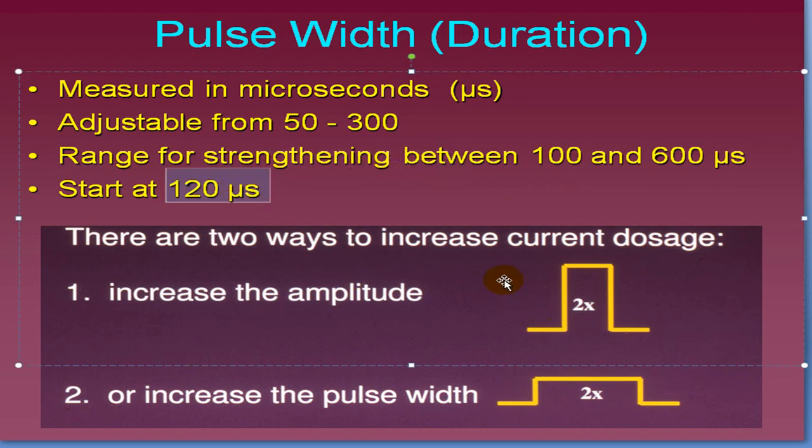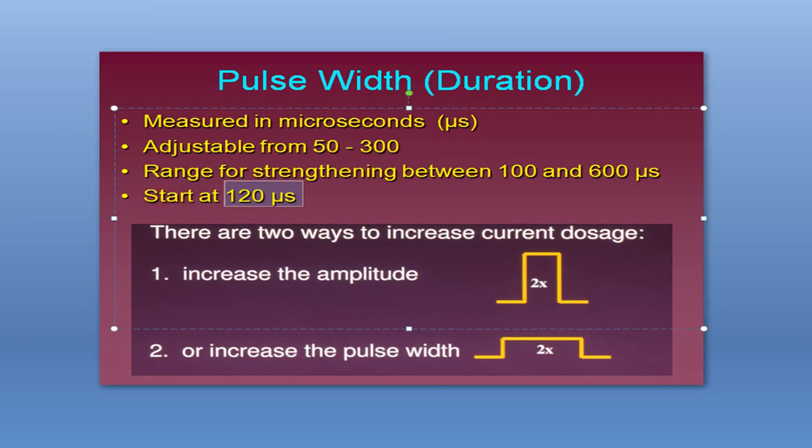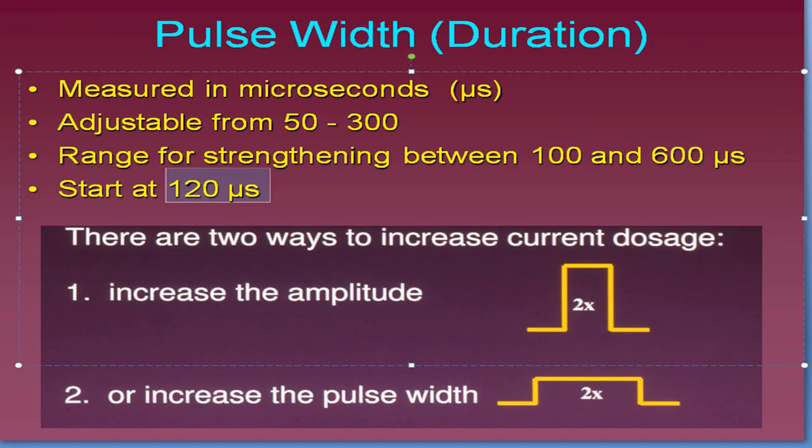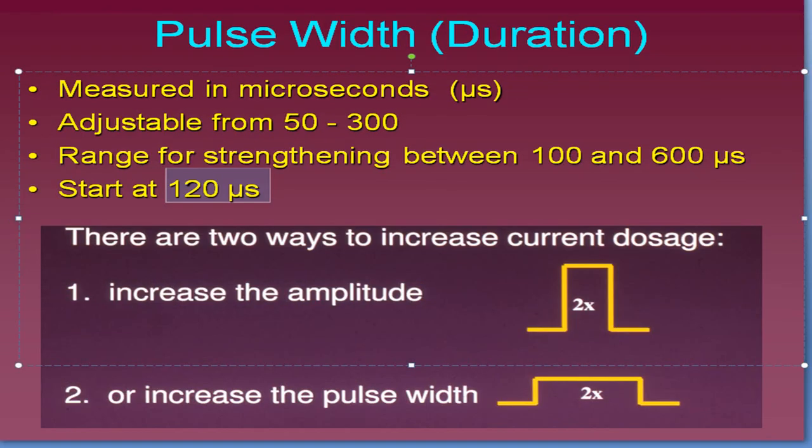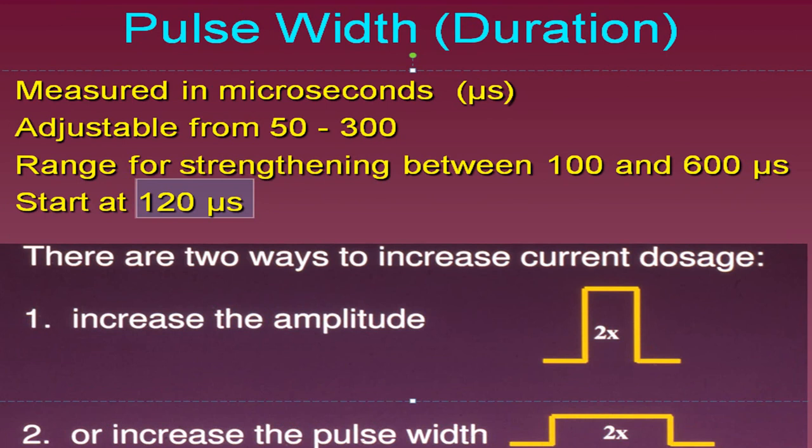You can increase the current dosage two ways. One is by the amplitude, or the dial on the top, and one is by pulse width, which is what we're talking about here. So again, I would not recommend too much change within pulse width. Try to set that at a good 120, 150 and stick with that. And during lab, I'll give you a chance to play with that as well, and get a feel for the difference between lower and higher pulse widths.